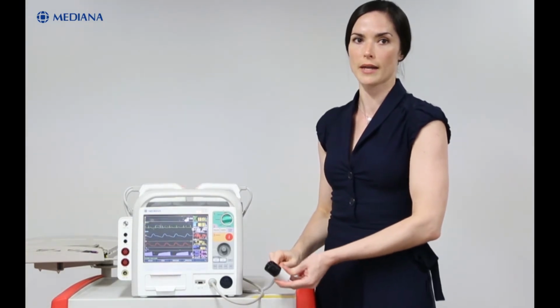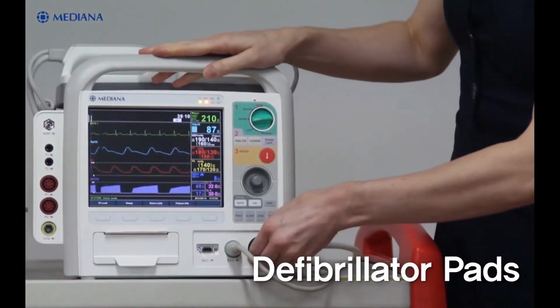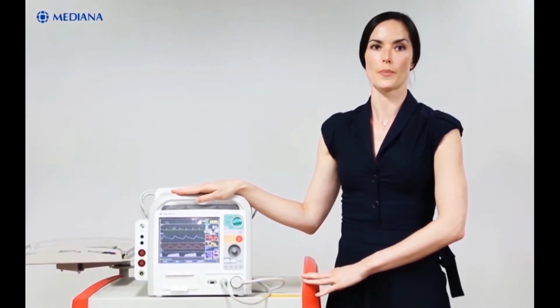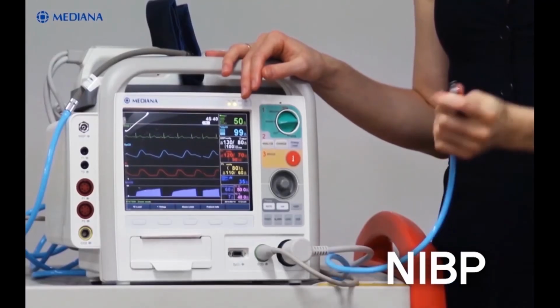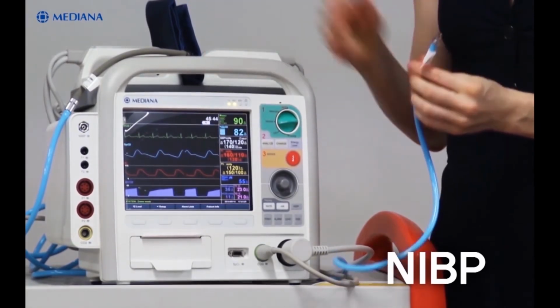Also, we have defibrillation mode, so you can connect a paddle or pads to their connector on D500's front panel. Finally, we can place the paddles or pads to the patient's bare skin, and that is all you need to do for the defibrillation. For NIBP use, we need NIBP hose and the cuff.